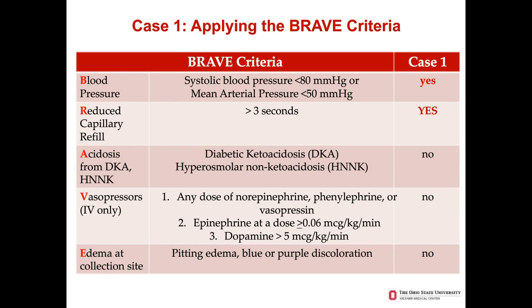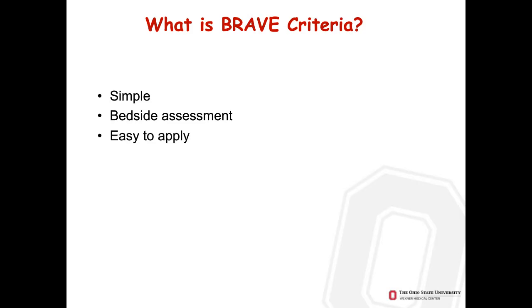So to reinforce the idea that this is very simple, it's a bedside assessment, and it's easy to apply to any patient, what I'm going to do now is go through a series of case examples where we looked at the BRAVE criteria and made a decision of how to obtain their glucose, then continued to reassess throughout the person's hospitalization.